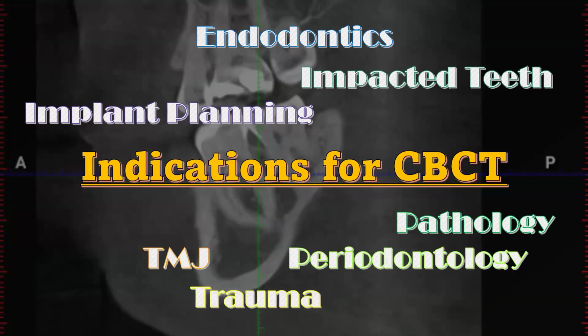Trauma, we talked about that. I haven't talked much about TMJ. So if I say cone beam CT is great at looking at bone structures, we have good resolution, you can see really well most osteoarthritic changes, because those have to do with sclerosis of the borders, erosions in the borders, what they call subchondral cysts, little small, well-defined round cyst-like structures adjacent to the articular surface. So most of those things you can see within the bone.